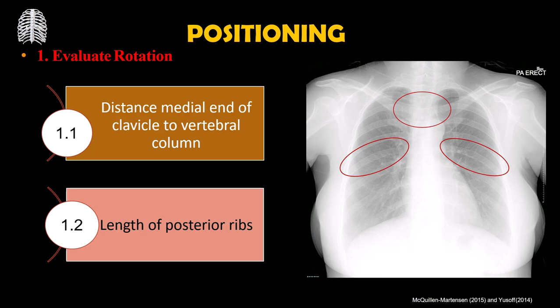How to improve this? We need to rotate the patient's body to the left until the MSP is perpendicular to the IR. This can be achieved when the patient's weight is distributed equally on both feet, and shoulders and arms are at equal distance to the IR.